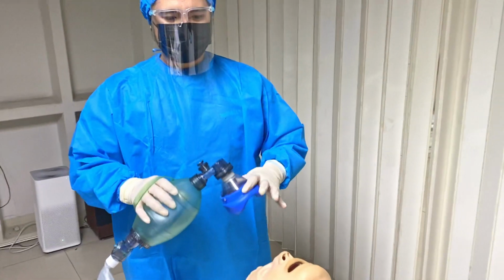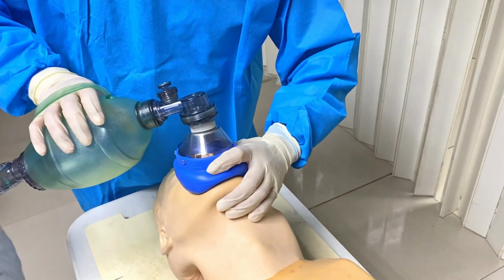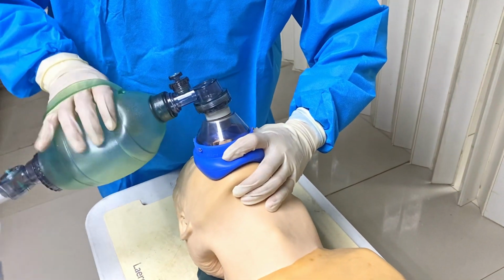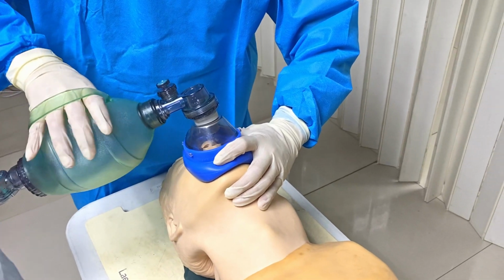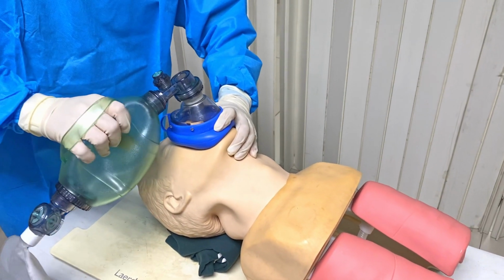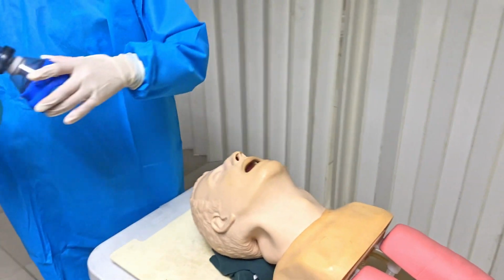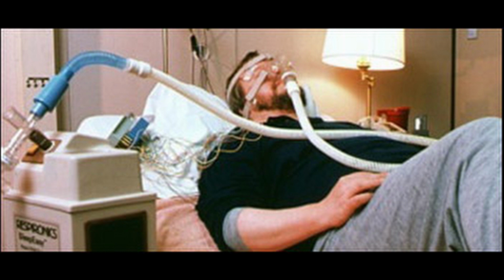Next, pre-oxygenate the patient prior to intubation to allow the patient to have reserved oxygen. A bag valve mask is used and held by using a C-E grip in order to achieve a tight air seal. However, in the case of an obese patient, pre-oxygenate with 100% oxygen for 5 minutes with continuous positive airway pressure or CPAP with a PEEP of 10 centimeters water or with non-invasive ventilation.